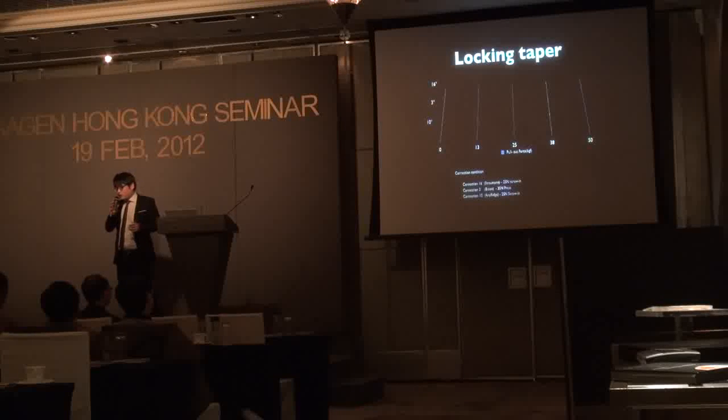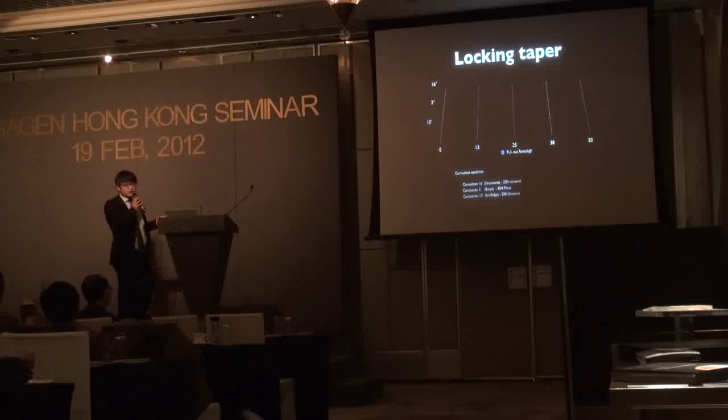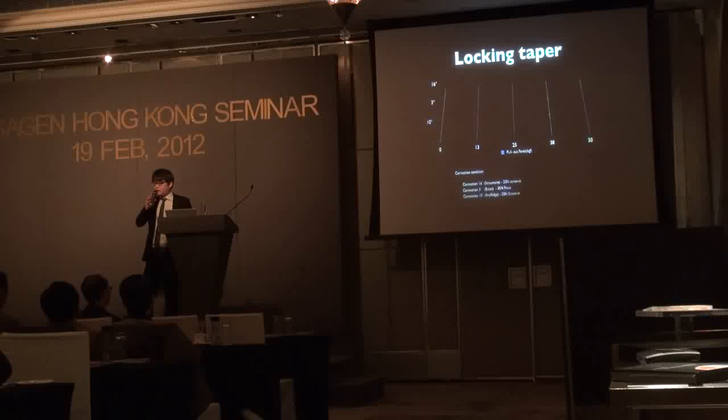After removing the abutment screw, we tested how many newtons we needed to take the abutment out of the fixture. The test result was like this.